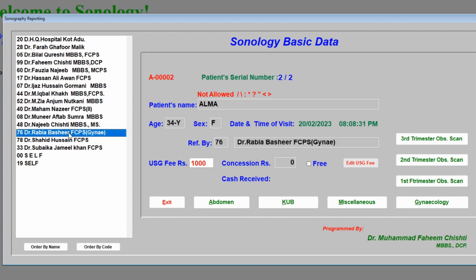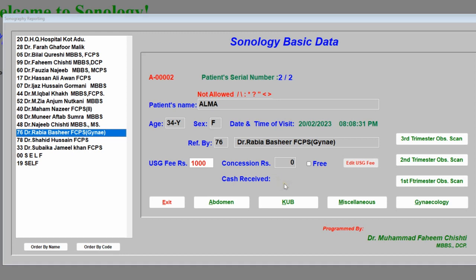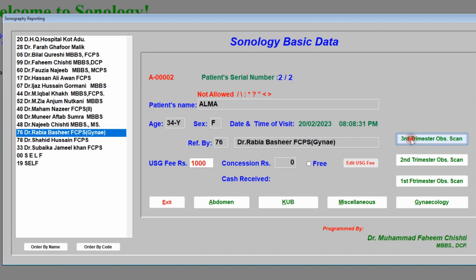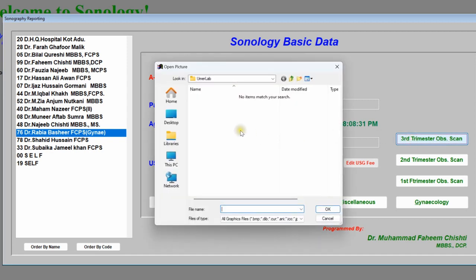Enter the referring doctor's name. Now you have to prepare the patient's ultrasound report. The method of preparing an obstetric report for the first trimester, second trimester, and third trimester is the same. Suppose we are going to prepare the report for the third trimester — click this button.